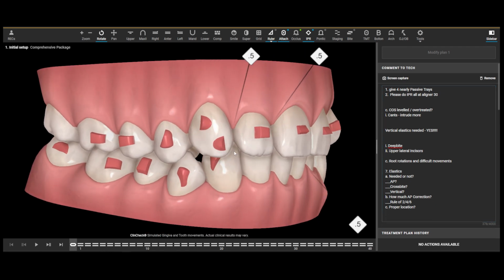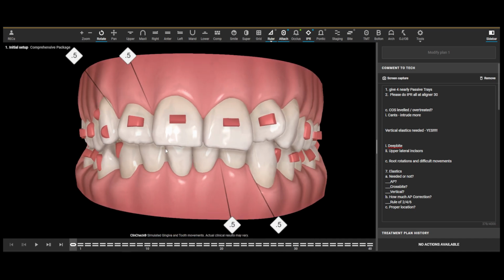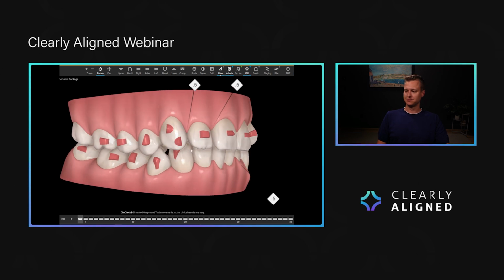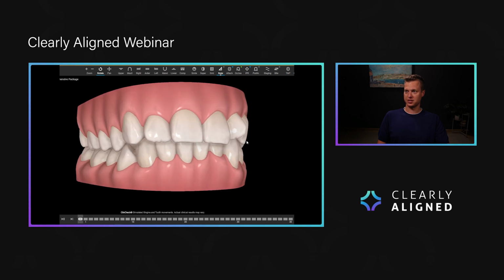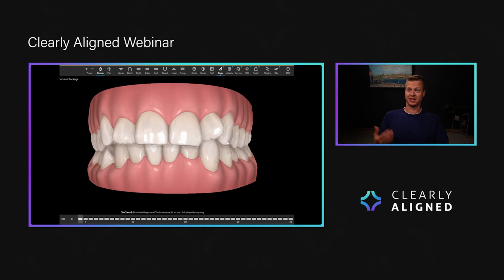Okay, last thing, root rotations and difficult movements. So of the teeth here, I'm not even gonna go ahead and show the tooth movement table or anything else. I just want you to look at this ClinCheck right now and tell me what teeth, don't even look at the attachments. Don't look at the IPR. Just look at the teeth. What teeth are the most crooked and have the biggest movements that need to happen? It's not rocket science.